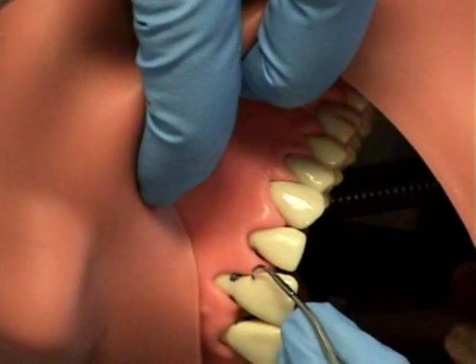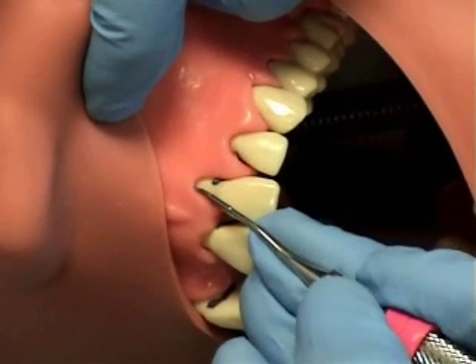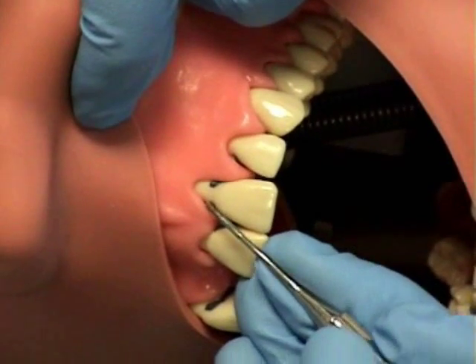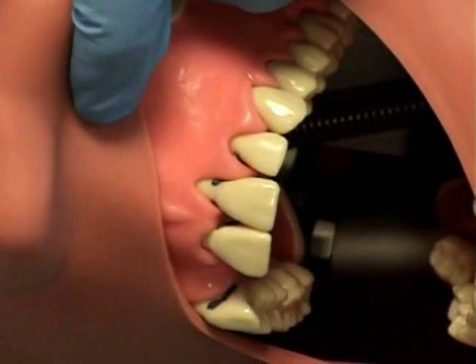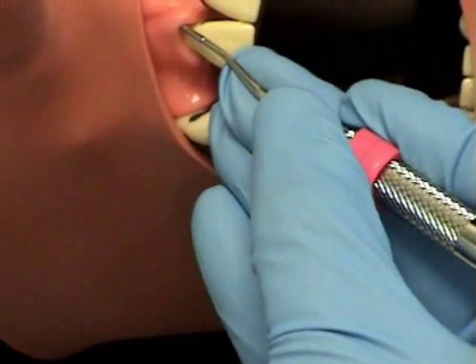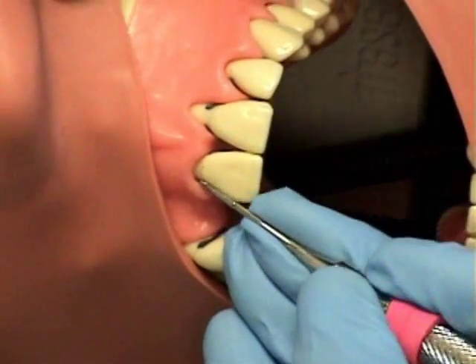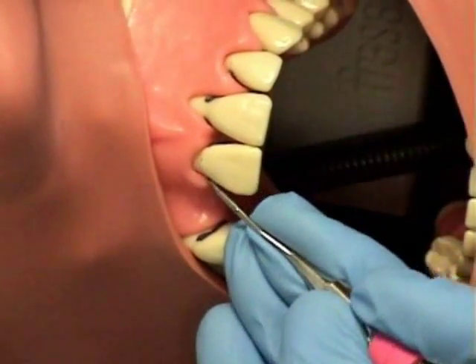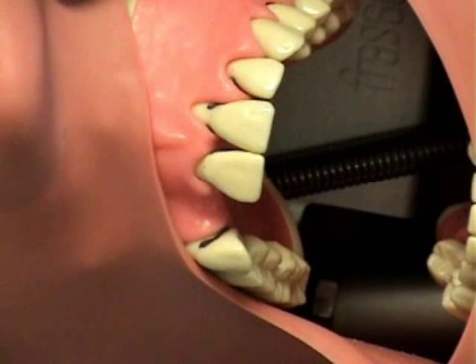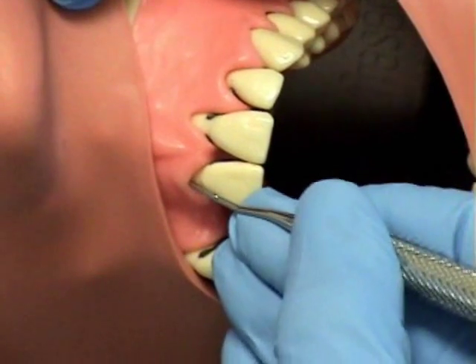It is so small that the manufacturer has provided blade identification marks which visually indicate the cutting edge. There is a plus sign on the handle. When using these smaller blades, this feature assists the clinician in quick identification. There are also millimeter marks on the shank. There's a raised band at 5 millimeters and there is a raised band at 10 millimeters. This helps the clinician visually assess the pocket depth during instrumentation to compare with periodontal charting and tactile sensations.